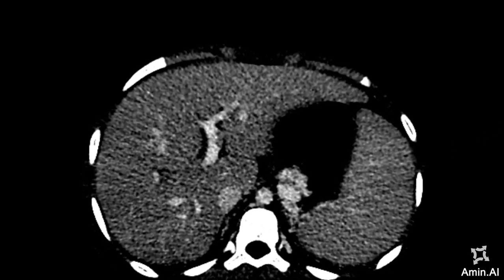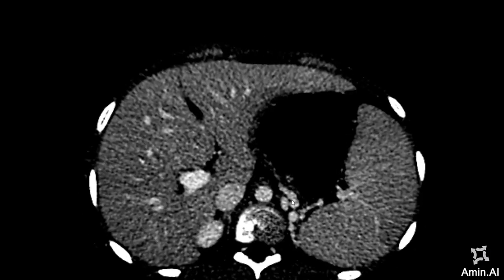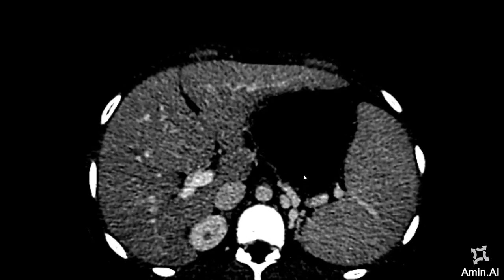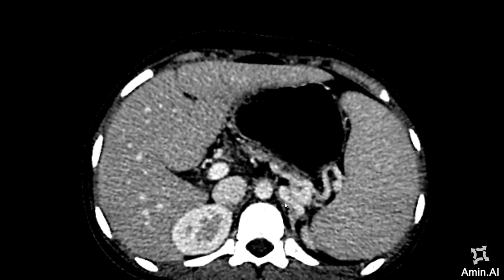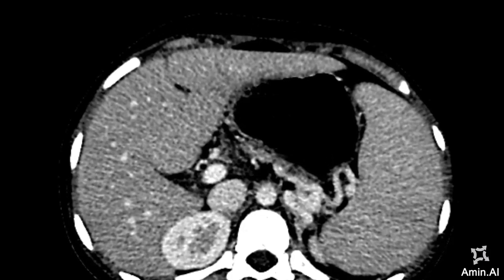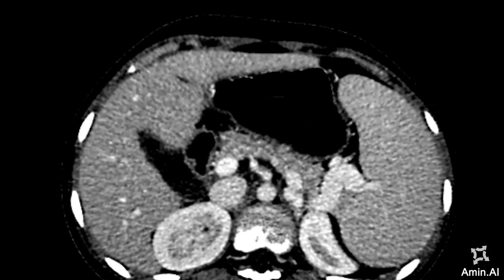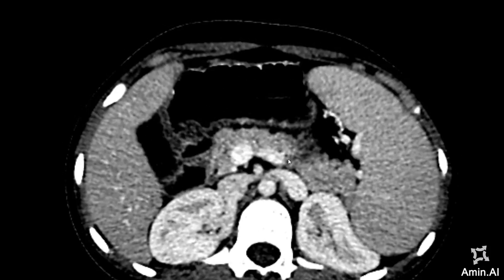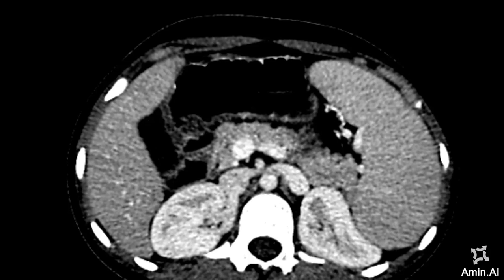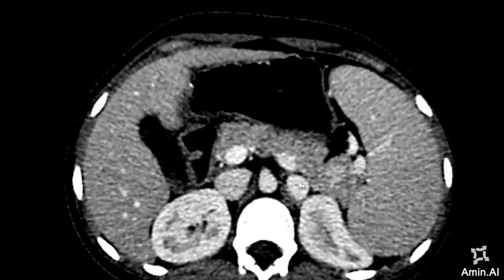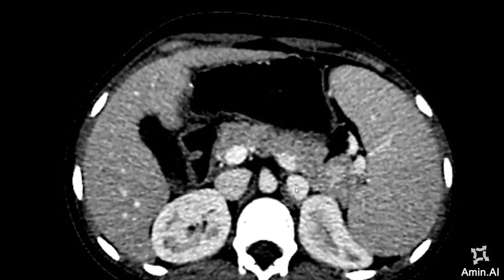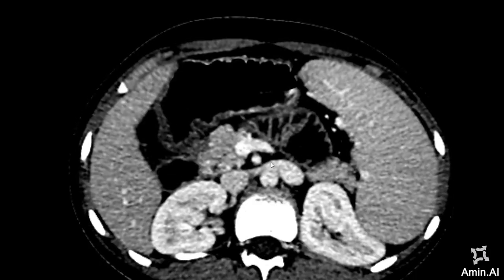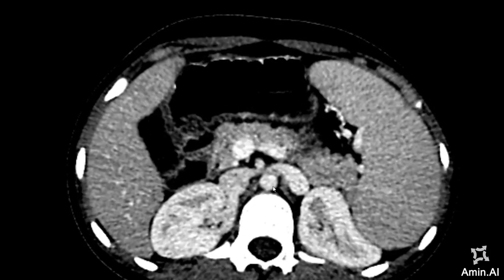Browsing inferiorly, you can see that this lesion is in connectivity with the vessels along the curvature of the stomach and is communicating with the splenic vein as seen in this region. These are then going to drain into the portal vein. There are also splenorenal varices seen, showing drainage of the veins into the renal vein, which is further communicating with the IVC.